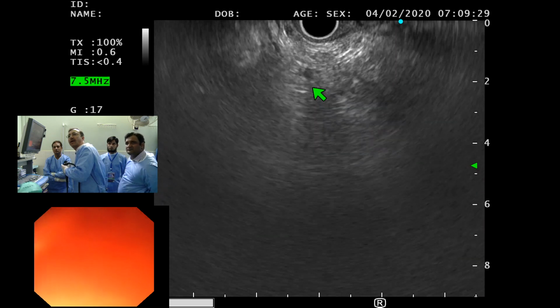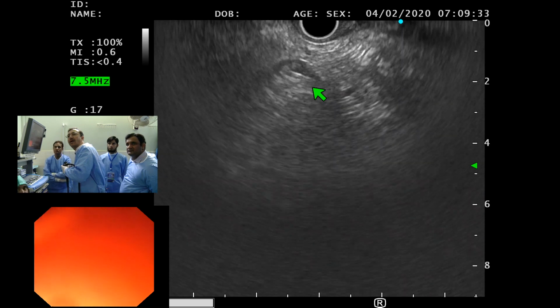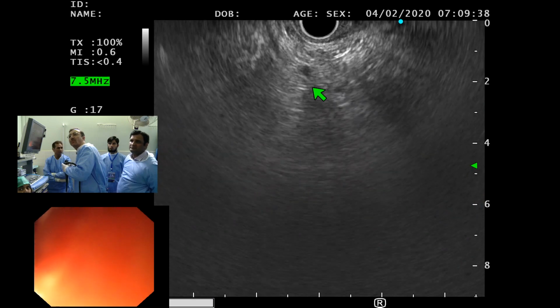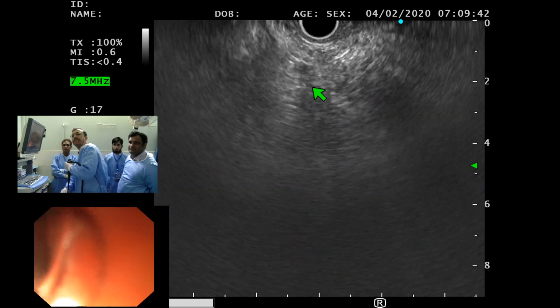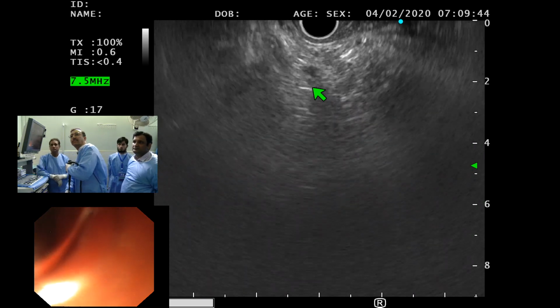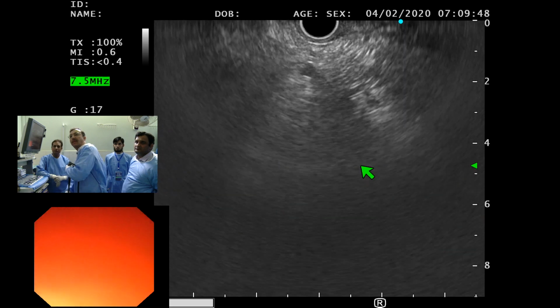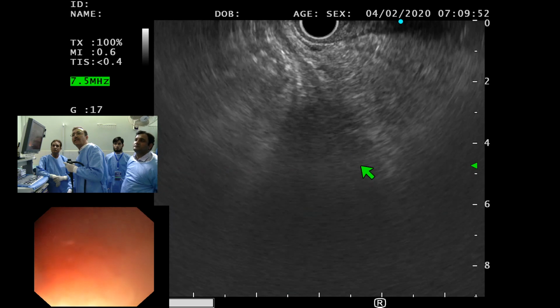Riyas, the lower duodenal end, can you focus on that a little bit? I'm trying to do that, but because of the deformity, I'm not able to go down. Yeah, that must be the problem, sir. This is the mechanism that I can see in this patient.